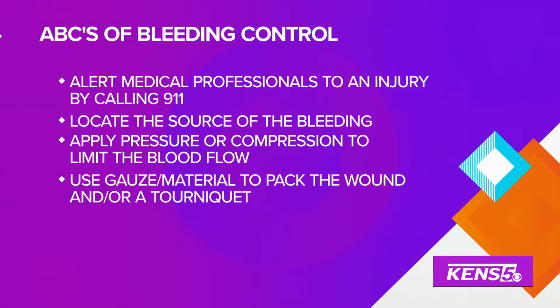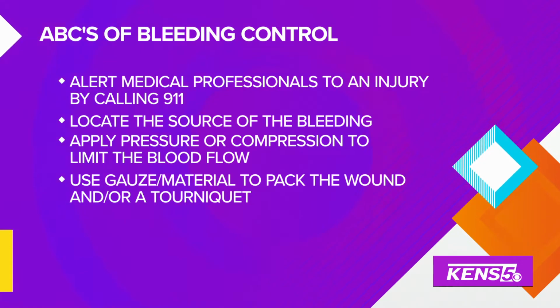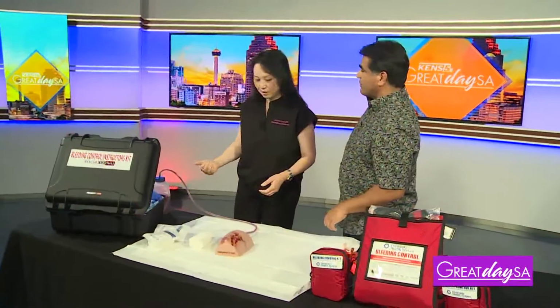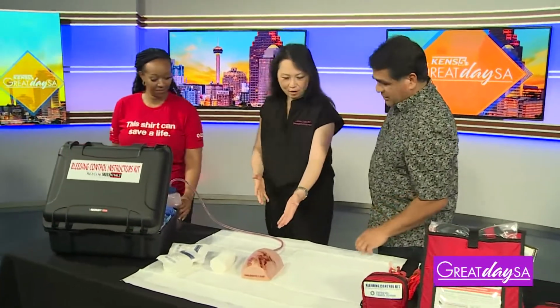Of course she's wearing a shirt, and there's blood everywhere and you don't know where it is. You've got to take it off and figure out where the blood is coming from. Okay, well show me what to do, doctor. All right, I'm going to have Tataka come here and show us what actual bleeding is like on this limb.